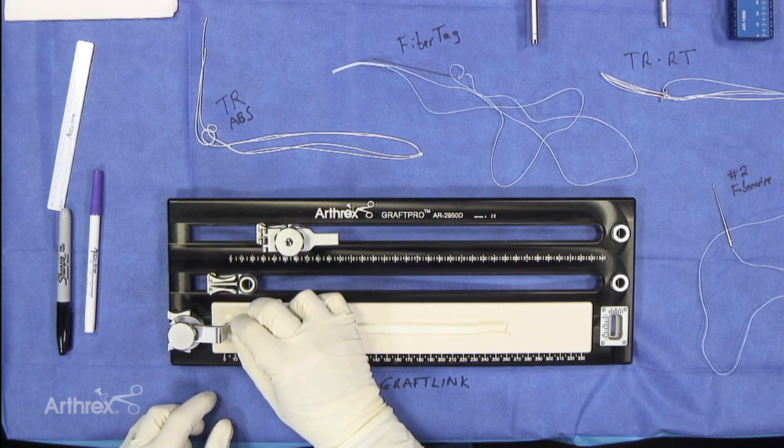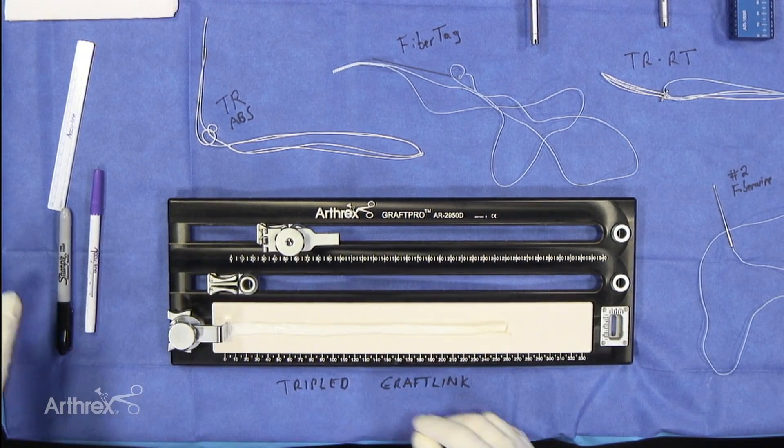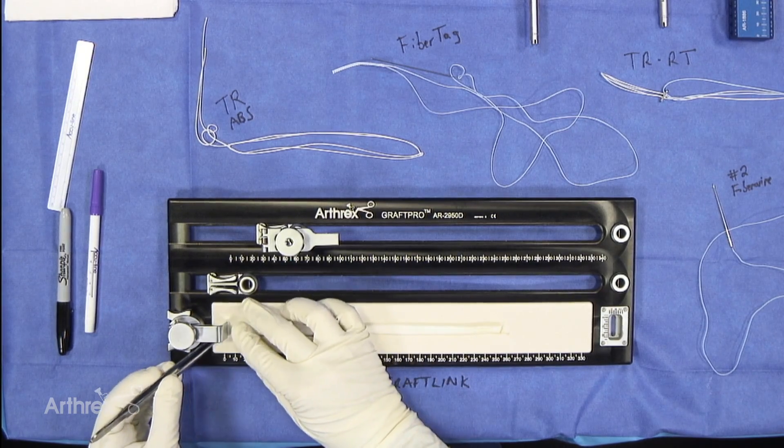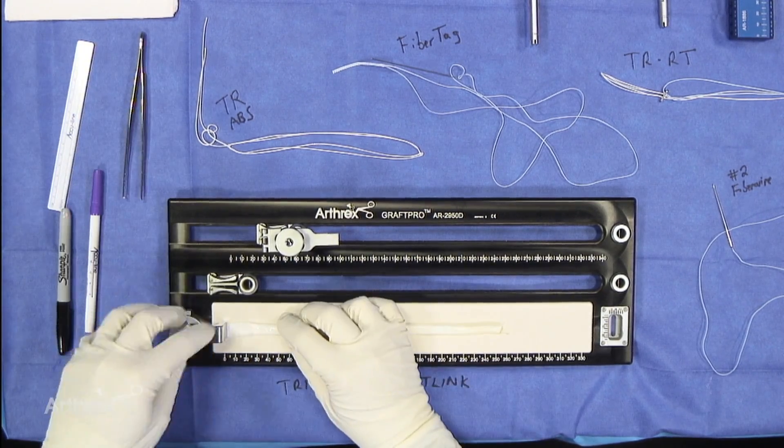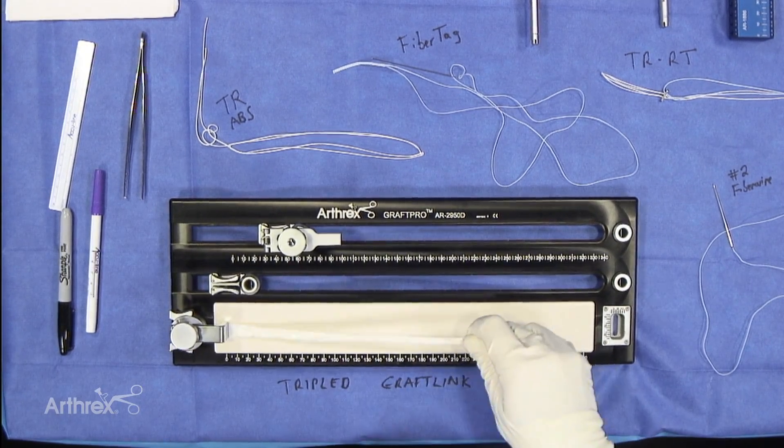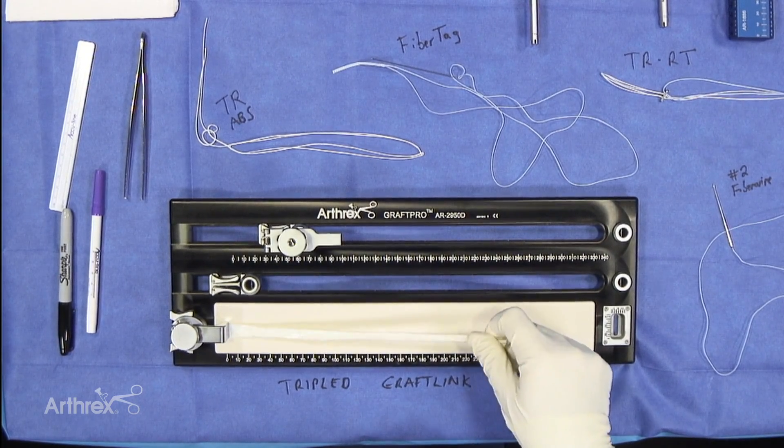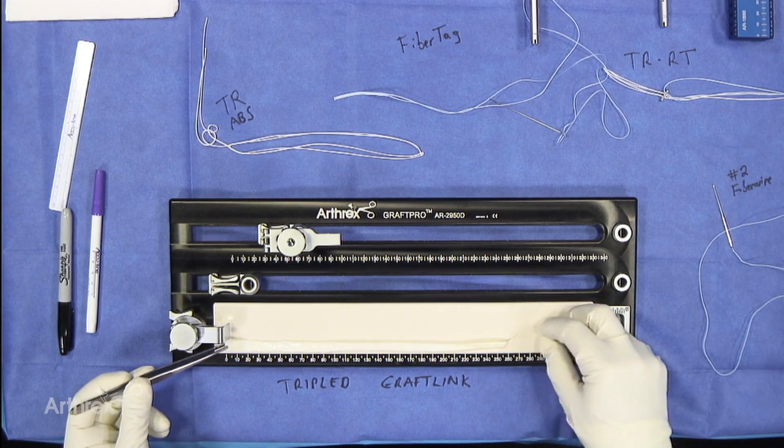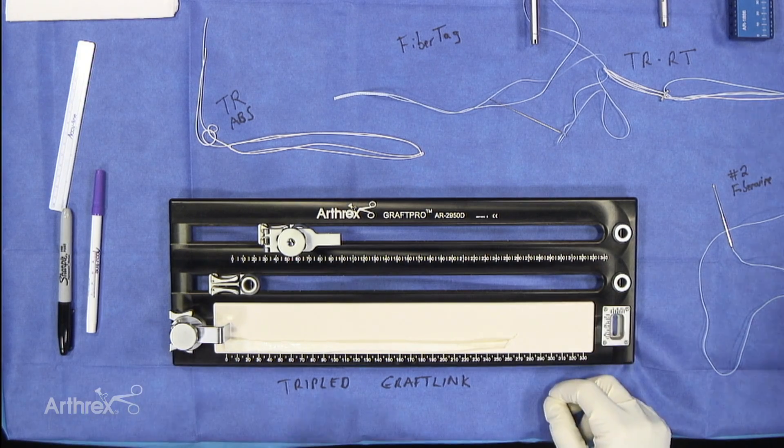Now one of the things I'm going to show you is a graft clamp. This is something relatively new, and you can put your graft in there, secure this down, and now you have great tension for suturing the graft. So this graft measures right around 25 to 26 centimeters.